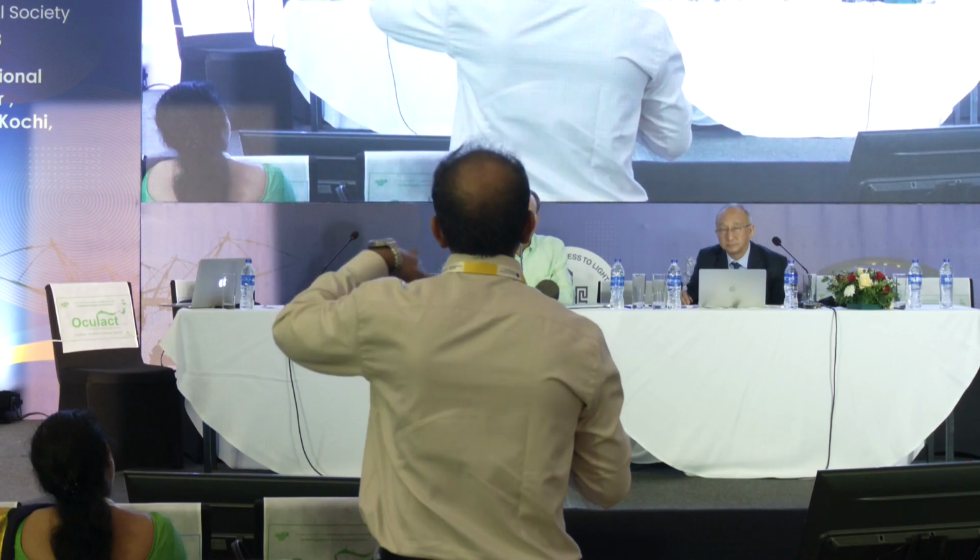After hydrodissection, if you do it with a single hand, you tend to pull the zonules wherever you are pushing. But here it is a push and pull technique, where the nucleus is rotated centrally without involvement of the capsule and the zonules. So it helps in maintaining the integrity of the complex.